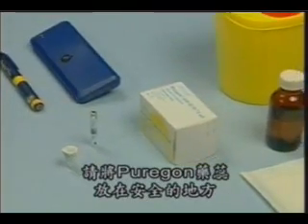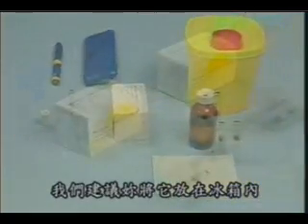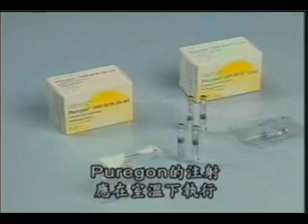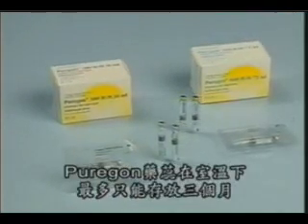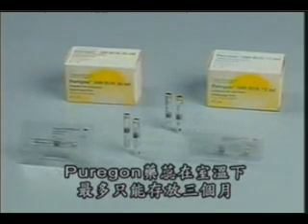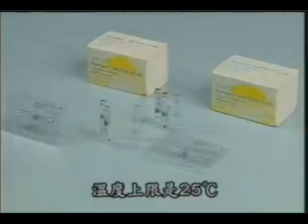Puregon cartridges should be stored in a safe place. The refrigerator is a good storage place. Puregon, however, should preferably be administered at room temperature. If you decide to keep it outside the refrigerator, please remember that you can only store it for 3 months at up to a maximum of 25 degrees centigrade.